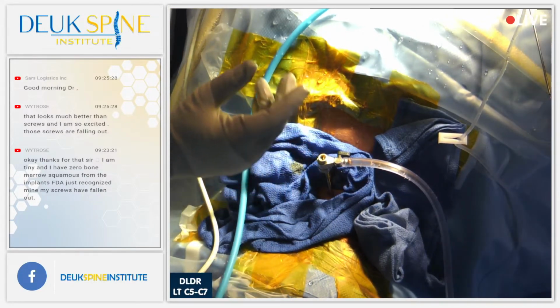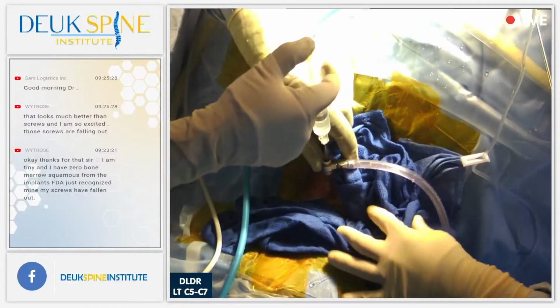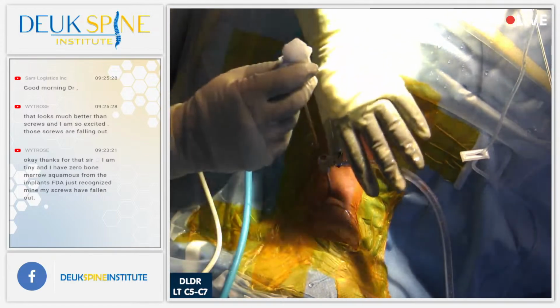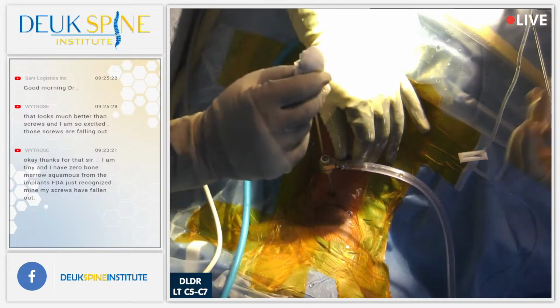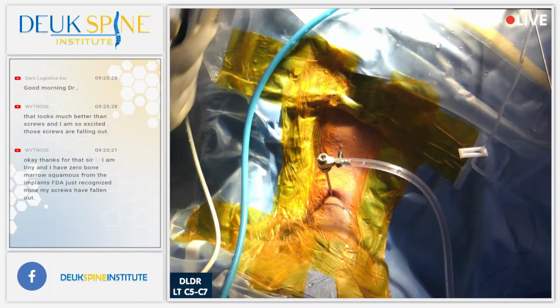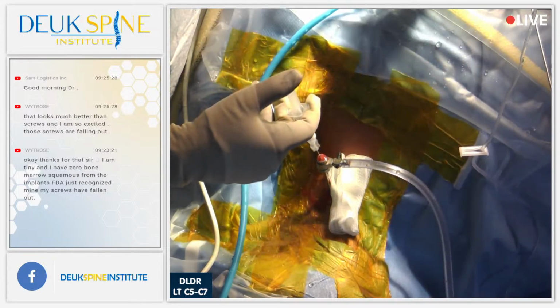We use antiseptics because when you do surgery, it's always good practice to cleanse the wound with an antiseptic that could kill bacteria or viruses or protozoans. We don't have protozoans and viruses obviously here, but we do potentially have bacteria. That's the real threat. The most common cause of post-operative infections in surgery in general, and not with the Deuk laser disc repair, is bacteria. It's bacteria that cause infections, not viruses. These are post-operative infections, so these are infections where we do surgery.